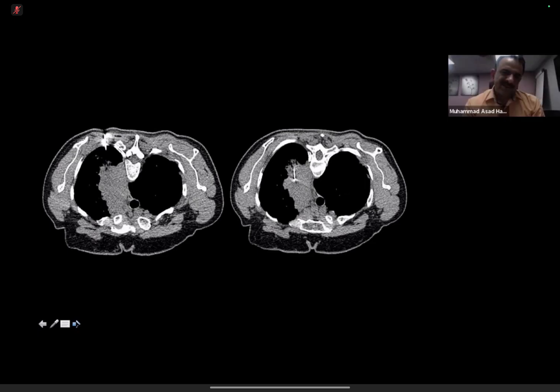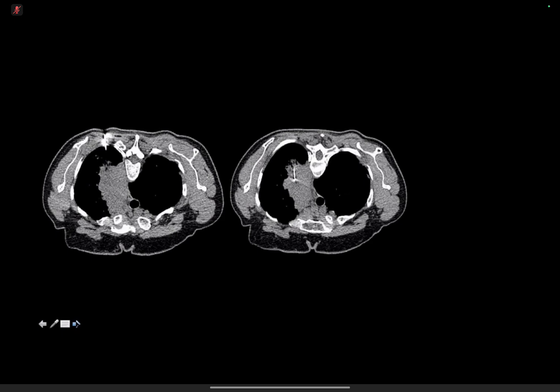Would you sedate this patient? I would hope to avoid it, because obviously any level of anesthesia, even sedation, has complications, and in most cases, this biopsy could be performed without sedation. It is potentially an option if the patient is very claustrophobic or very needle phobic, but it's still felt to be essential to get the tissue.